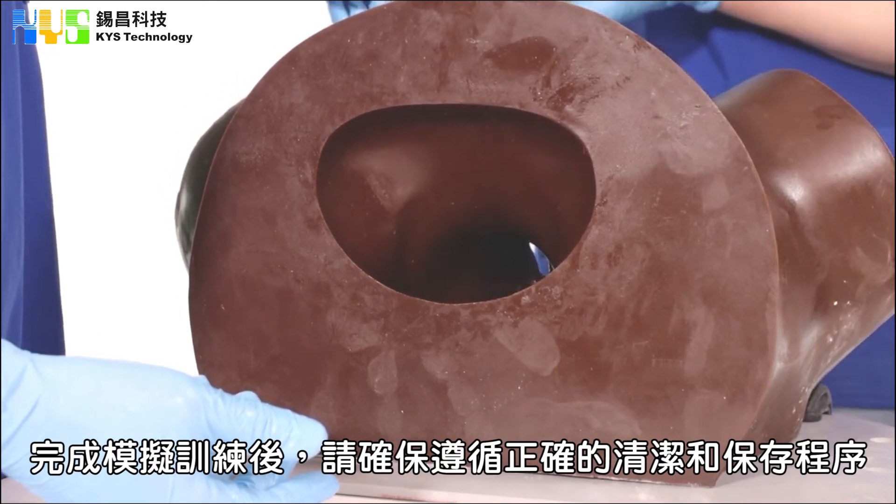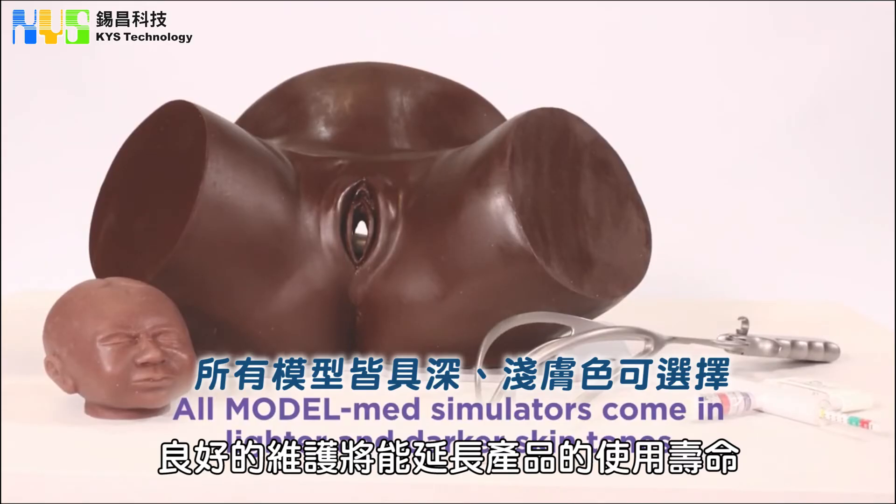Once you have finished your simulation, ensure you follow the correct procedure for cleaning and storage. If you treat them with care, they will be long lasting. If you have any further questions, visit the ModelMed website.